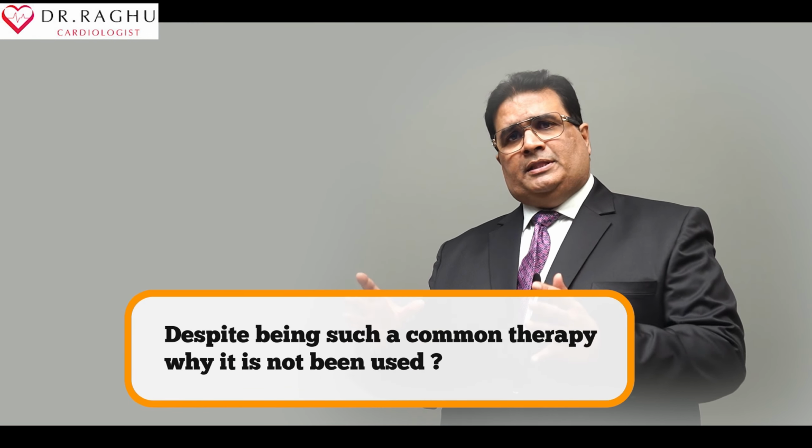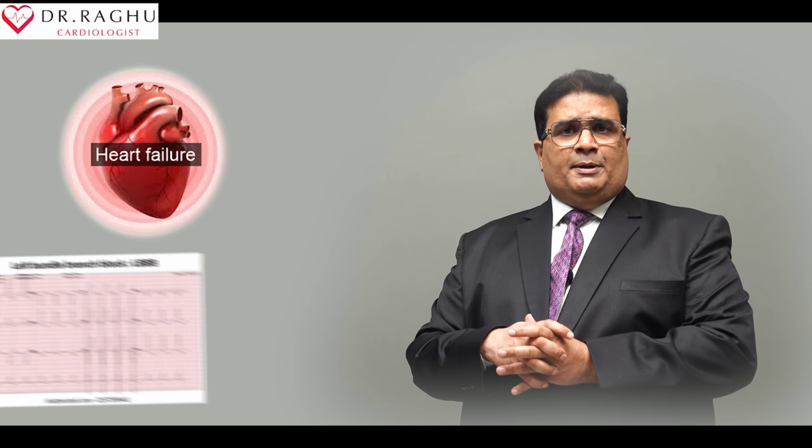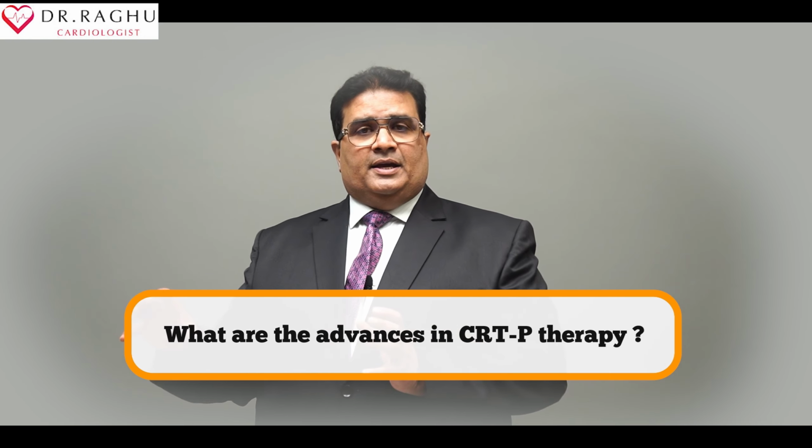Despite being such a common therapy, why is it not being used more? Heart failure and LBBB is a very common problem in these patients, but unfortunately the therapy is still evolving and clinicians are also still not aware of which patient is a responder and which is a non-responder. So advising this therapy is not up to the mark. What are the advances in CRT-P therapy?